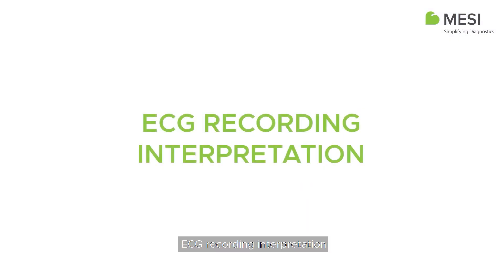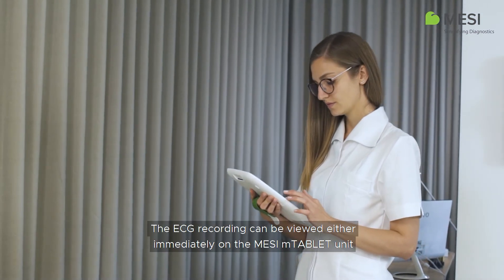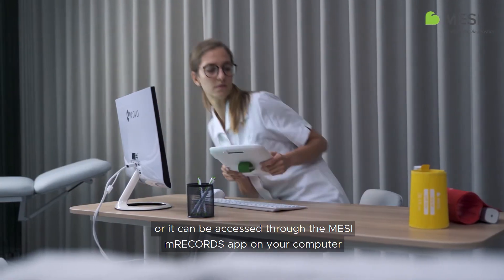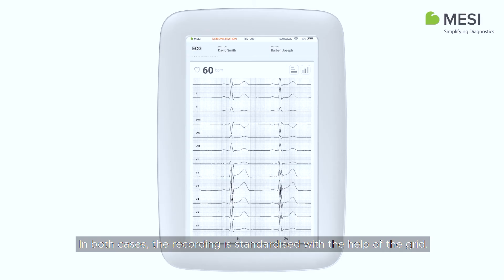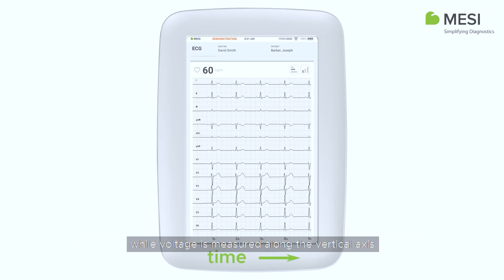ECG Recording Interpretation. The ECG recording can be viewed either immediately on the MESI mTABLET unit, or it can be accessed through the MESI mRECORDS app on your computer for further analysis. In both cases, the recording is standardized with the help of the grid. Time is measured along the horizontal axis, while voltage is measured along the vertical axis.